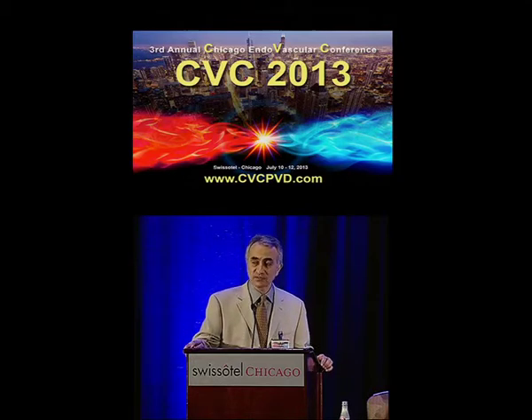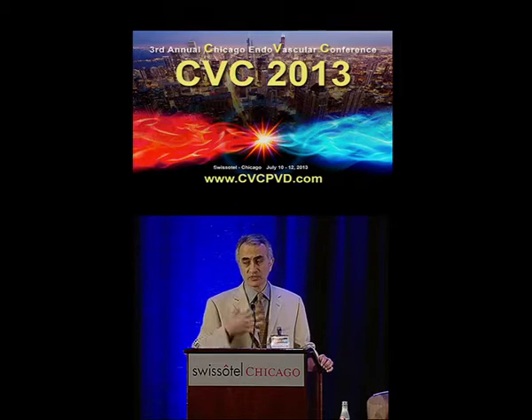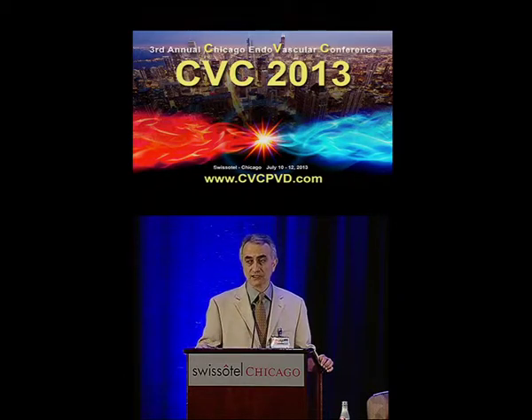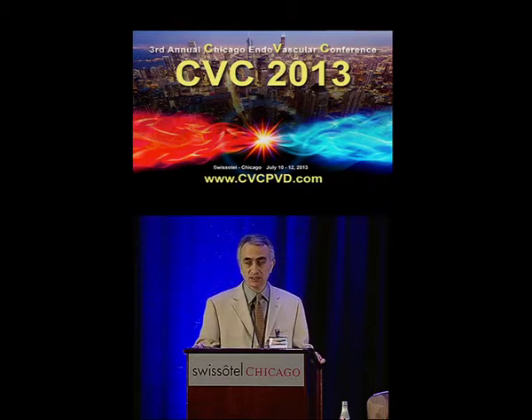No doubt that if you put a stent in there, within 6 months that's going to recur. In our limited experience with stent grafts in that location, if you can maintain the patency, it has been better than stents alone. So personally, I stent graft across the thoracic outlet in dialysis patients if, number one, that is the culprit for access failure or the patient is symptomatic with arm swelling, and number two, if angioplasty fails in front of my eyes.